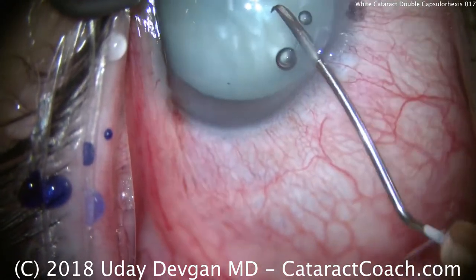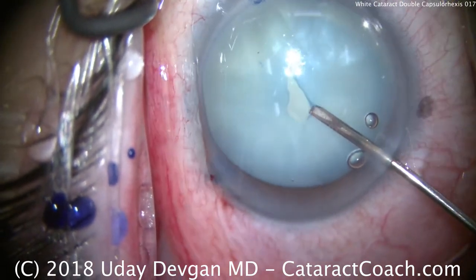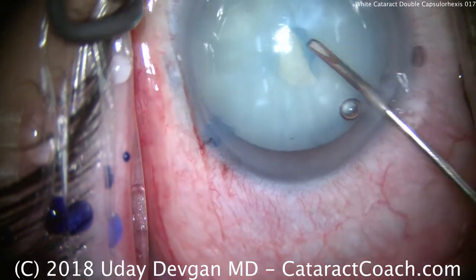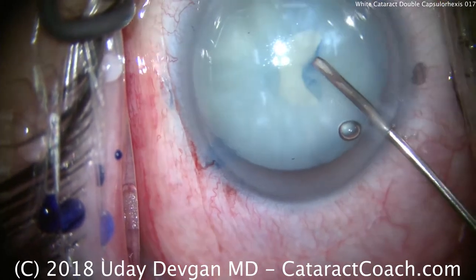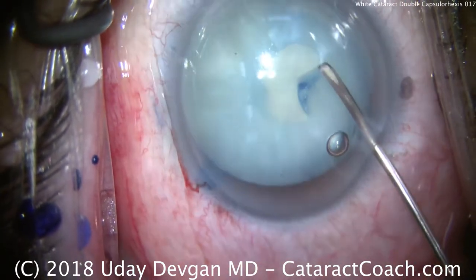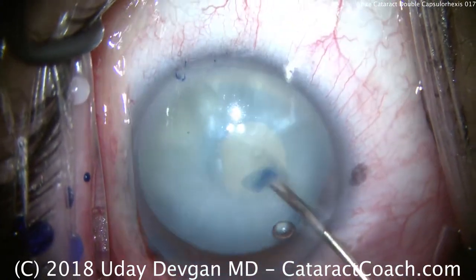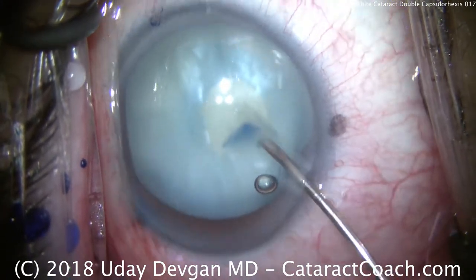Next, we'll place a scissotome through the paracentesis. We'll puncture the lens capsule and we're going to try to create a tiny little baby capsulorexis just using the scissotome. We want to do this quickly and efficiently. We don't want to allow too much fluid to escape from the lens. There's a milky white lens — there is fluid there. The reason we're not getting too much fluid escaping is that we have the anterior chamber pressure very high, probably 40 or 50 millimeters of mercury. So now we have a complete capsulorexis, albeit a very small and eccentric one.